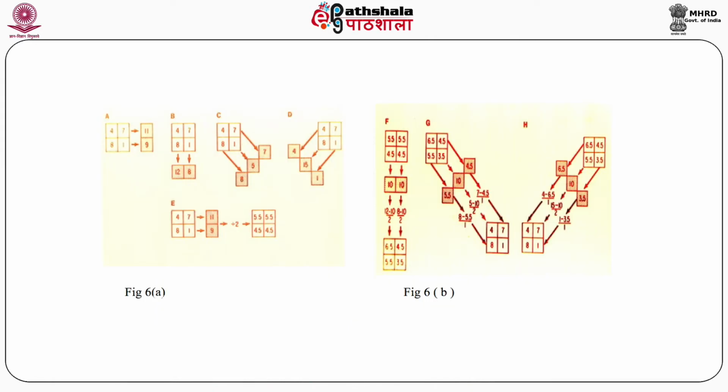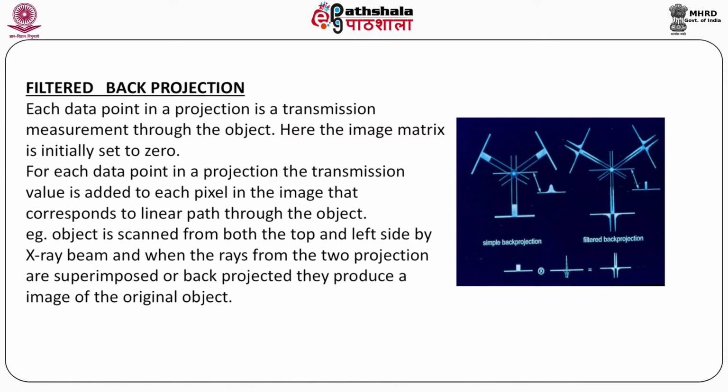In that case, you can see the iterative methods have been used to define how the total value of linear attenuation coefficient can be utilized to find the individual value of linear attenuation coefficient of each slab of tissue. We can call it a voxel, which is a three-dimensional representation of a two-dimensional pixel. So during the reconstruction process we can find the individual value of linear attenuation coefficient.